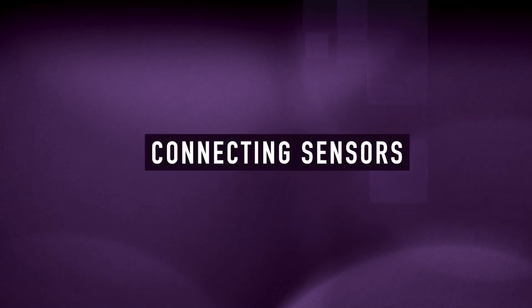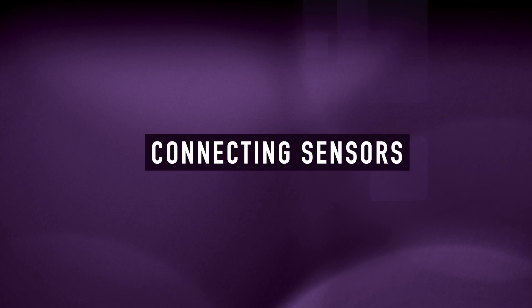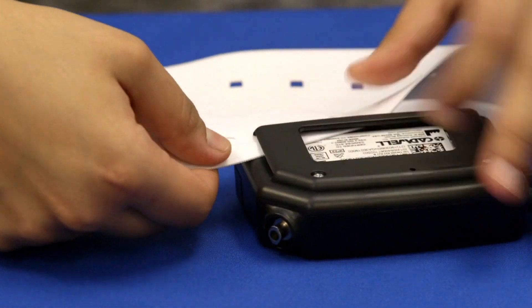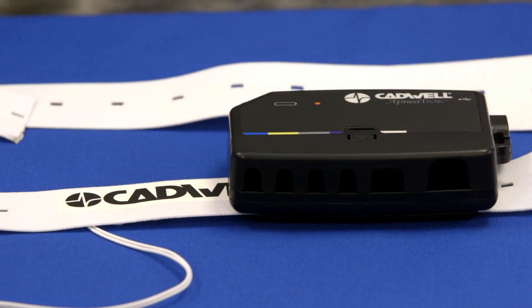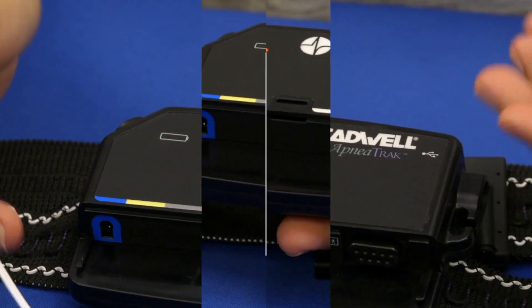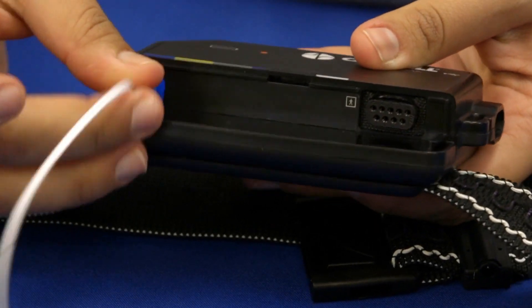If your provider has already sized the belts and connected them to the device, skip to the chapter 'Wearing Your Apnea Track.' Connect the apnea track to the chest belt over the Cadwell logo by sliding the belt up under the clip on the back of the apnea track, ensuring the logos both face the same direction. To remove the port cover, press on the arrow and slide the panel down. Connect the blue input from the chest belt cable into the blue port.